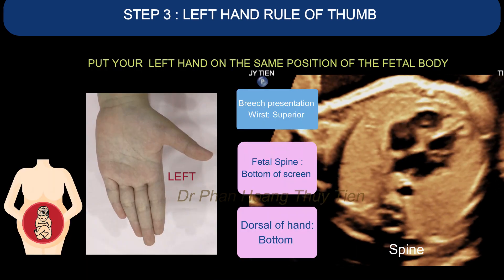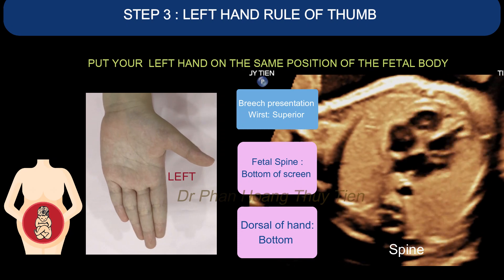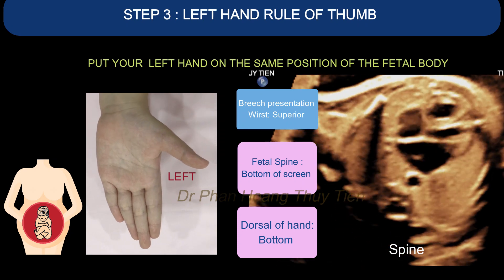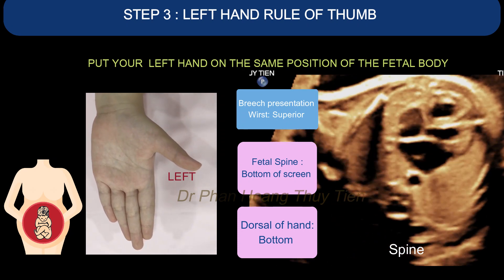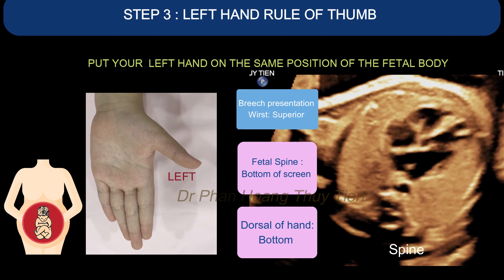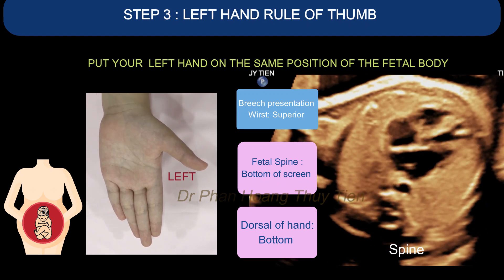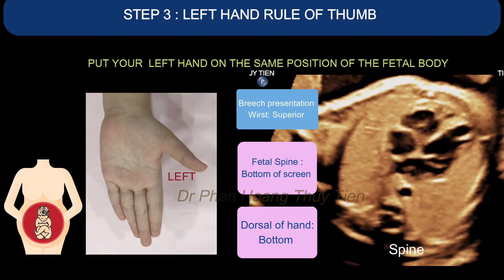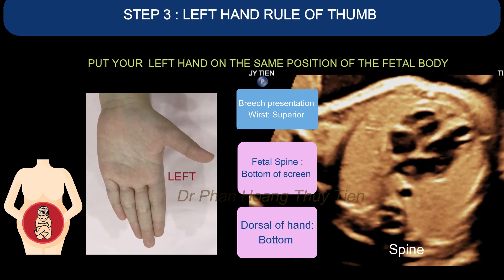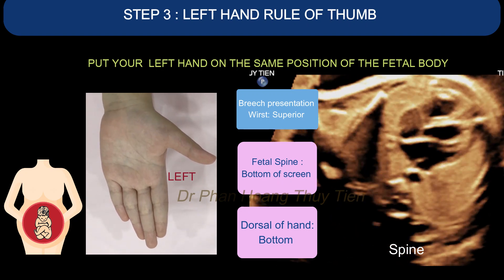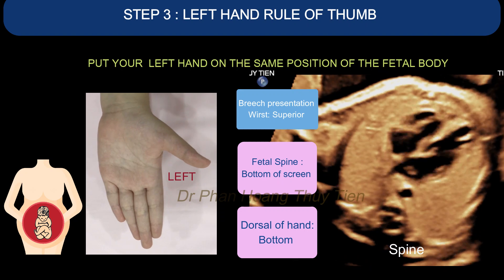Put your left hand in the same position as the fetal body. This is a reminder that since it's a breech presentation, the wrist — which is the fetal head — will be superior. In this example, the fetal spine is at the bottom of the screen, so your hand dorsal will be facing downward.